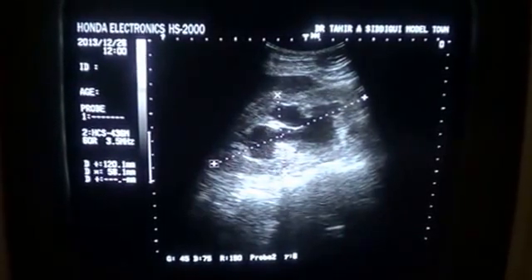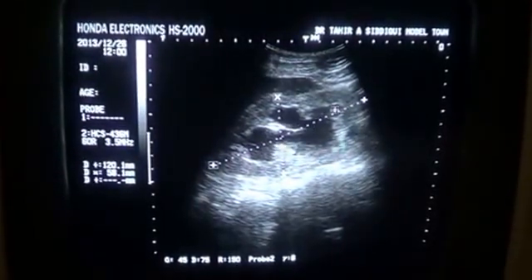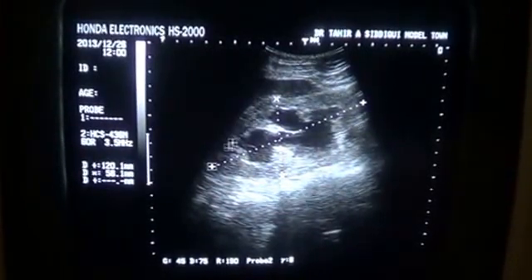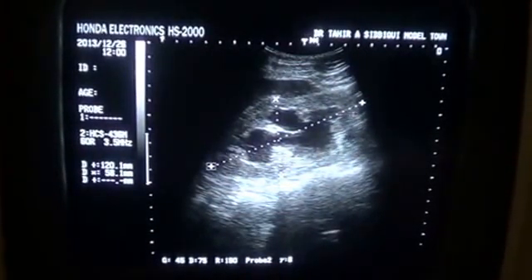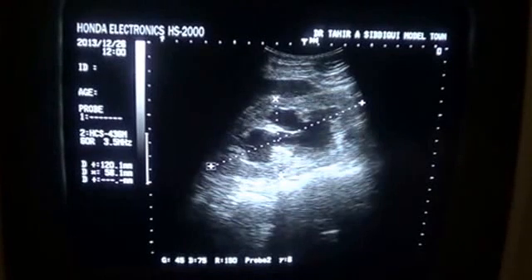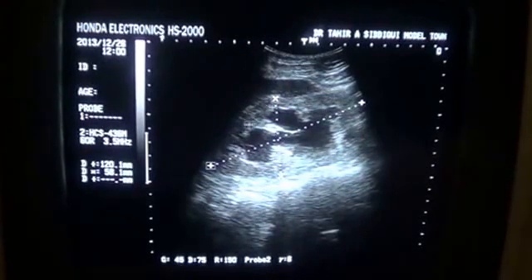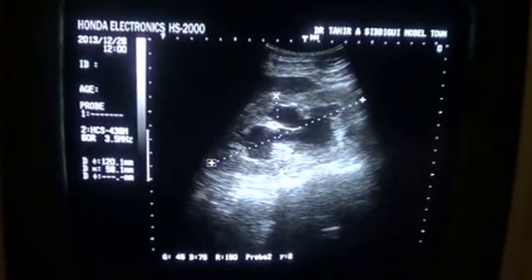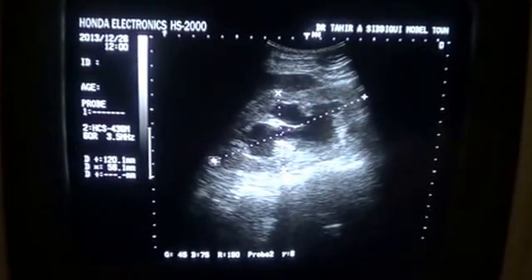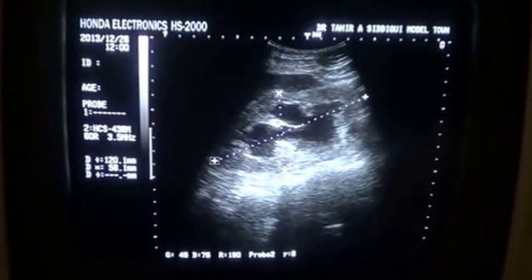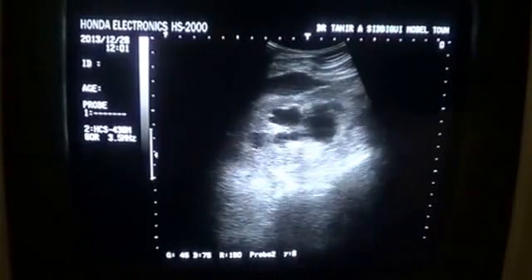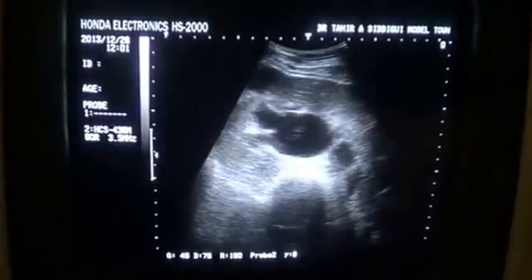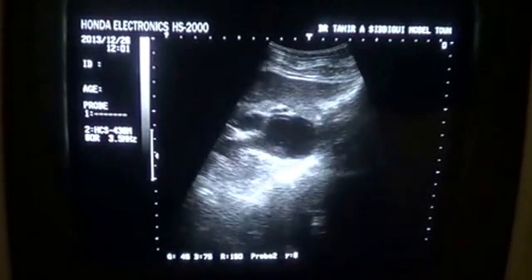These are the upper pole calyces, the mid region, and this is the lower pole. The parenchyma thickness is preserved all over, but the corticomedullary differentiation is muffled and the echogenicity of the parenchyma is diffusely raised. That is the right kidney. Now this is the renal pelvis.